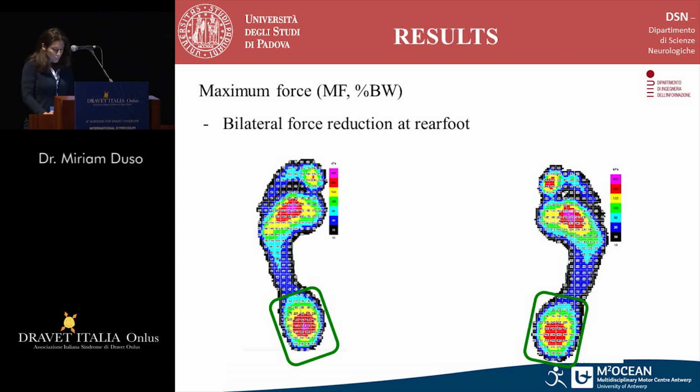These variables we calculated on the footprints that were obtained by making the patients walk on the pressure matrices. And these footprints were then divided in areas in order to study them thoroughly. You see the areas in the boxes. It's the forefoot, the midfoot, the rear foot, lateral and medial foot, and also the whole foot.